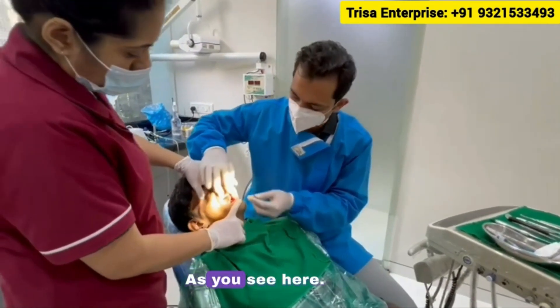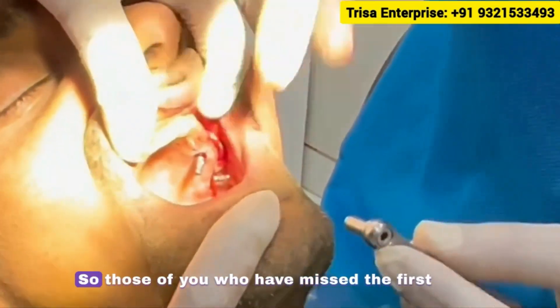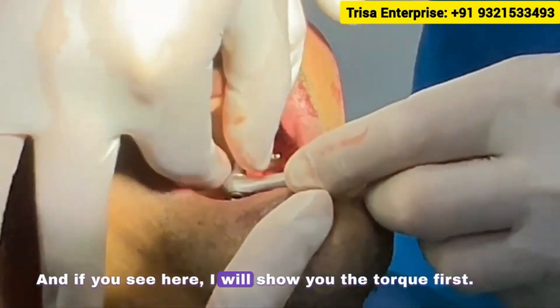Right now I'm showing you how to bend the basal zygomatic implant. As you see here, I have already placed the zygomatic implant. For those of you who missed the first part, you should catch up on that. I will show you the torque first.